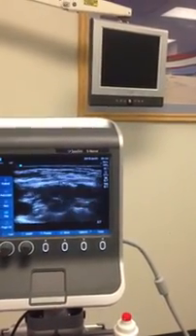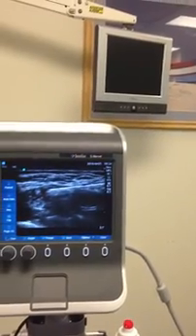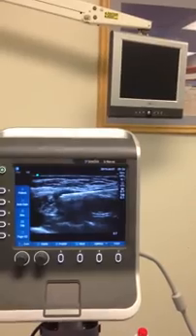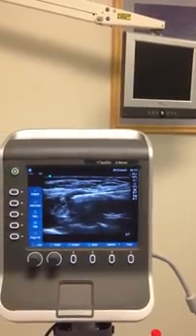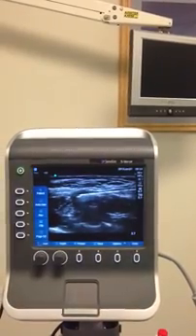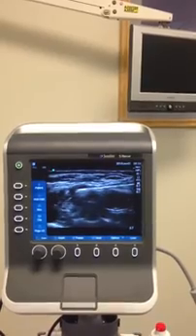This is going to help me achieve a shoulder block without getting a block in the patient's hand or elbow. The total function of their hand and elbow gives a lot more comfort to the patient. That's it — that's all 15cc's.